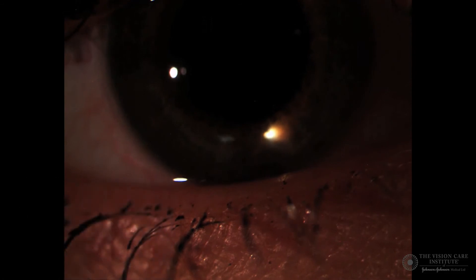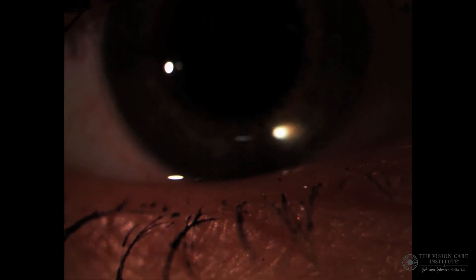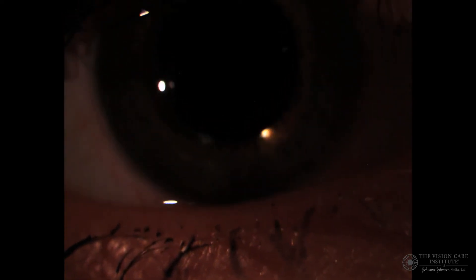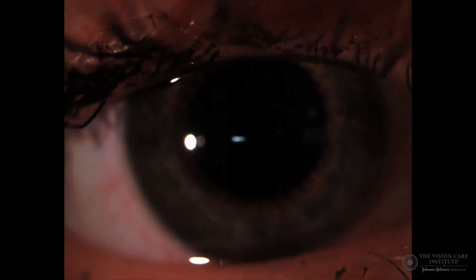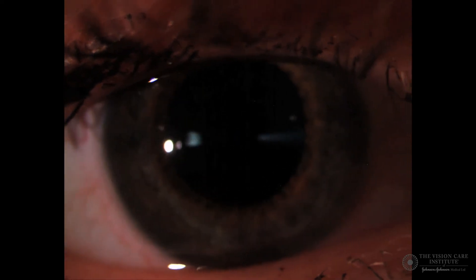We then move the combination upwards so that it is over the pupil itself. Once we have this, it might be very dark and we might not see anything until we focus correctly as we're doing here. We will now be able to see the conical section of the cornea and the light scatter off the lens, which is in fact the blurred conical section of the lens.